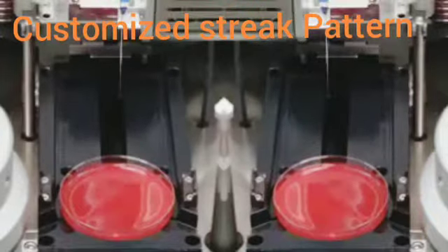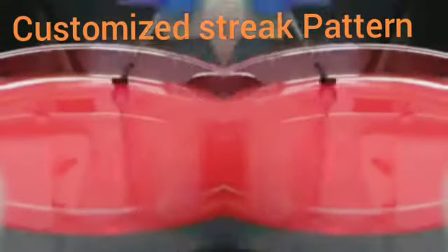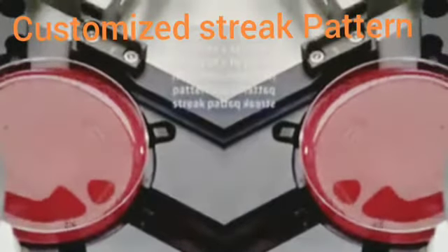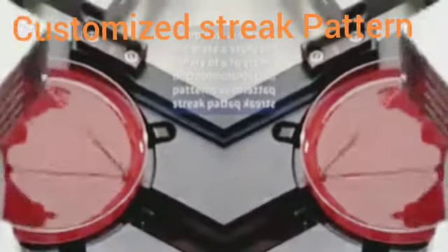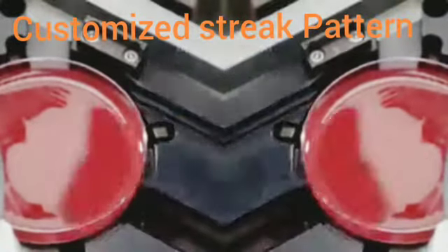After the sample is obtained, the loop is presented to the loop check to ensure accuracy of plating. The sample is inoculated onto the plate using one of a library of classic microbiology streak patterns honed by years of expertise in reading plates. WASP can also accommodate customized streak patterns.